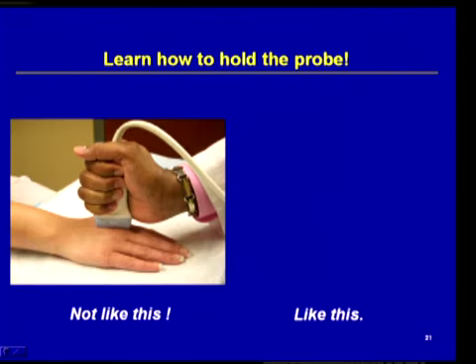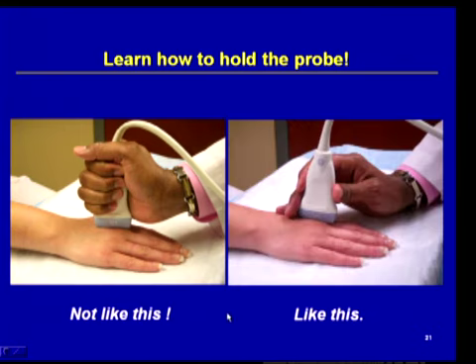One of the other key things is learning how to hold a probe. I always have to remind people that the probe is a fine, delicate tool. It's not like a Black & Decker drill. So you don't want to hold it like a vigorous tool like this. When you're holding it, you want to hold it like a fine tool.